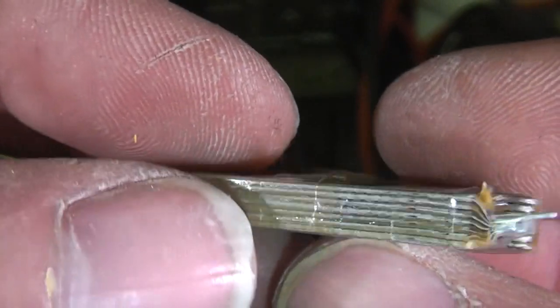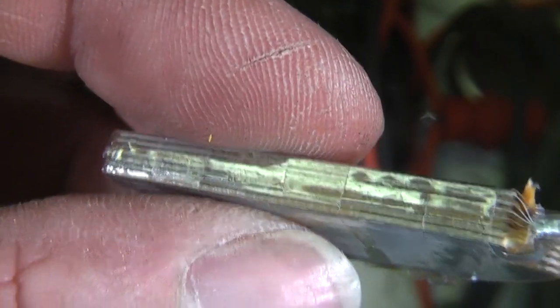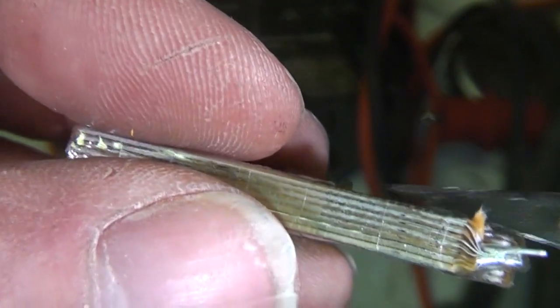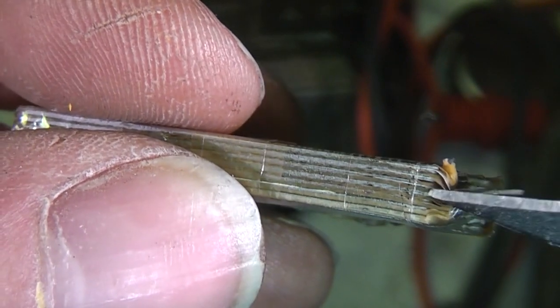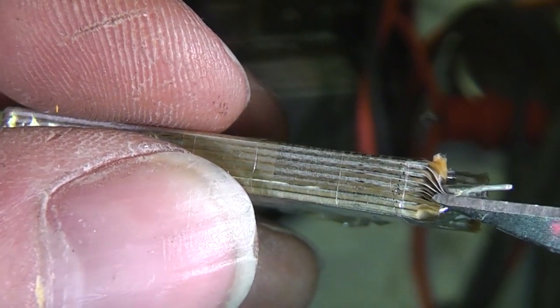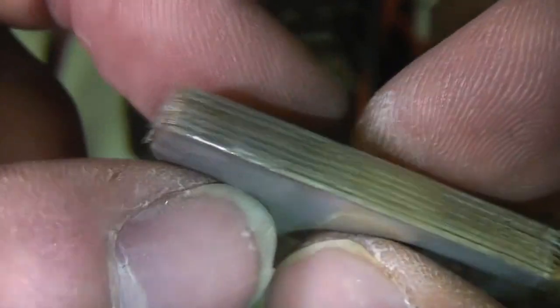This is the inside of one of these capacitors. I think it's basically an unrolled electrolytic. It certainly smells quite similar to the insides of a standard electrolytic. But obviously because of the form factor, they've just used flat plates instead of rolling them up into the normal cylindrical form factor. You can see the multiple parallel plates. So these plates are all connected in parallel to each of these electrodes. So it's fairly conventional tech, just in a slightly unusual shape.